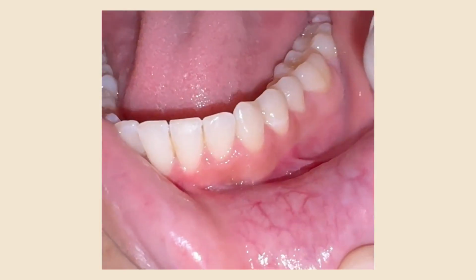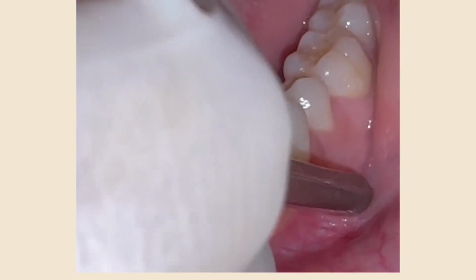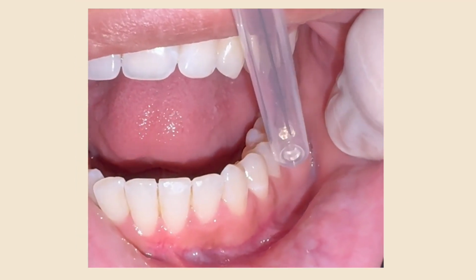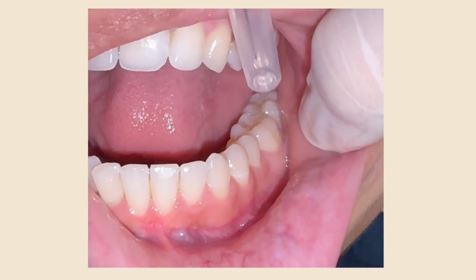Here is a live demonstration for mental nerve block. First of all, locate the mental foramen with the index finger. It is usually at the apex of the second premolar. Then direct the syringe in that area. Slowly deposit anesthesia after aspirating.